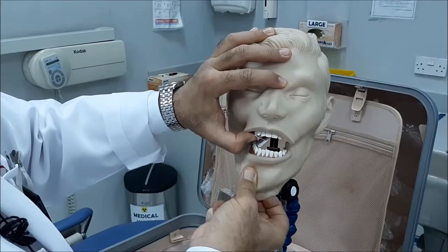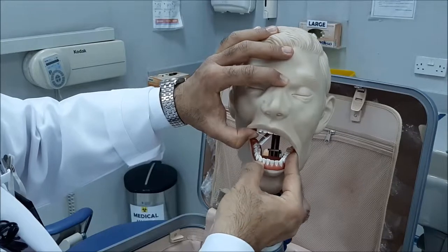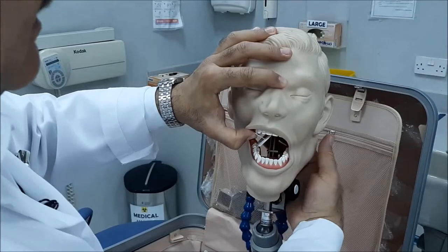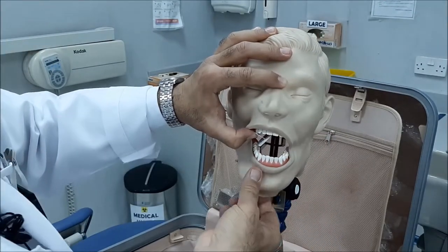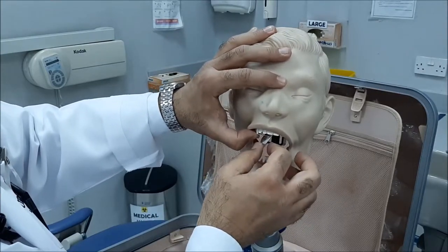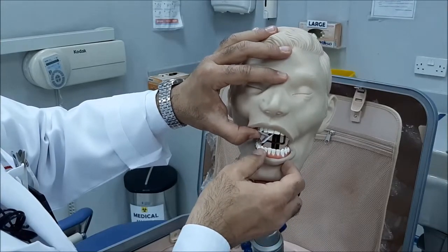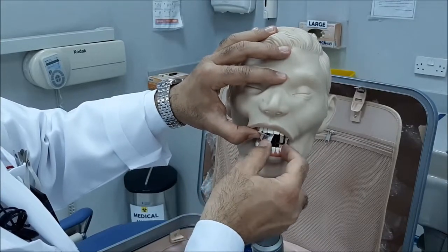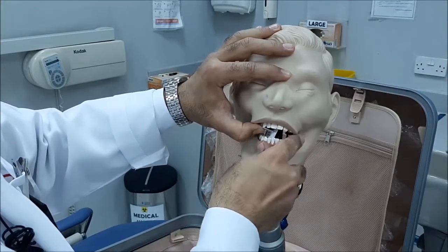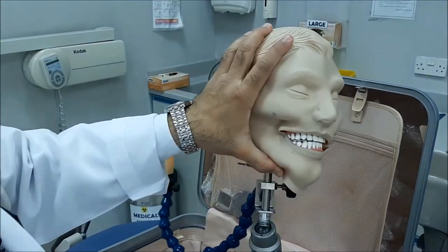What happens sometimes is that we overlook the other end of the film, and then when the patient is going to bite, he bites incorrectly. So before biting, premolars in the middle — these are the two premolars biting on the tab. When I feel there is interference, I take it away, then ask the patient to bite. This is how it should look in the final position.